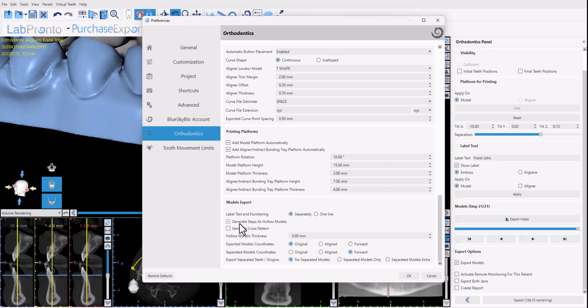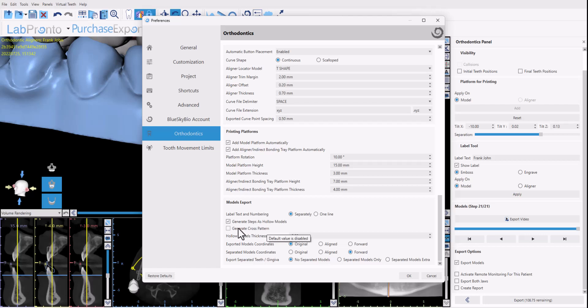While we're here I'll just point out we have other options. By default the checkbox generate steps as hollow models which means the models will be printed as hollow models to save printing time and material. You do have an option to generate cross patterns so if you don't want it to be open from the bottom it could be closed with a cross pattern if you check the checkbox here.